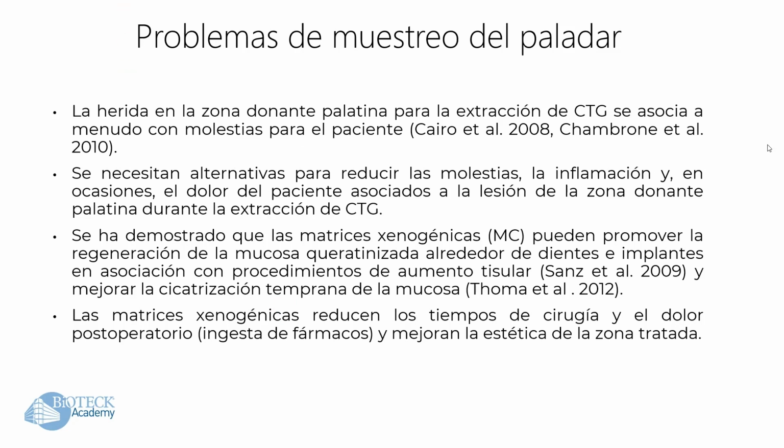These are the issues related to palate harvesting for the connective tissue graft.